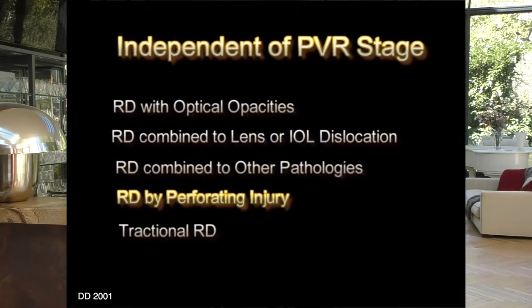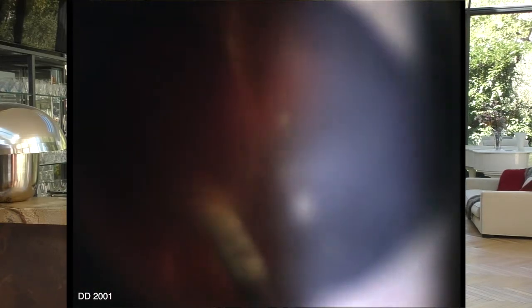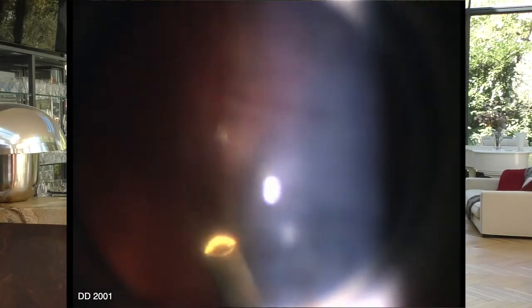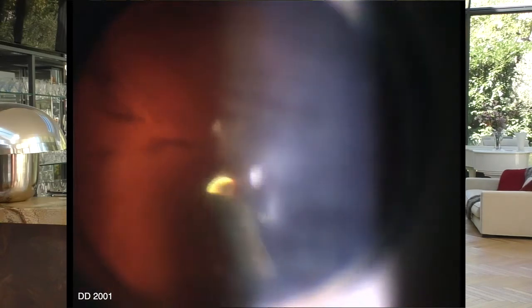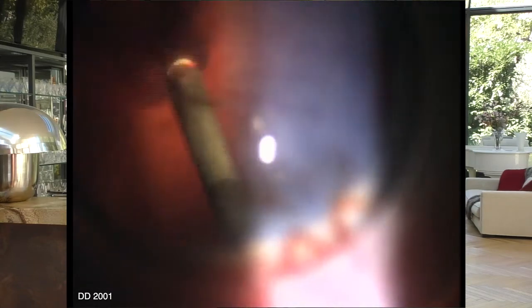Vitrectomy indication is virtually constant for an RD caused by perforating injury. In these cases, we must remove the posterior hyaloid for a faster and easier vitrectomy, but most of all, for providing a preventive measure by removing the collagen skeleton necessary to the organization and development of PVR and/or fibrovascular proliferation.